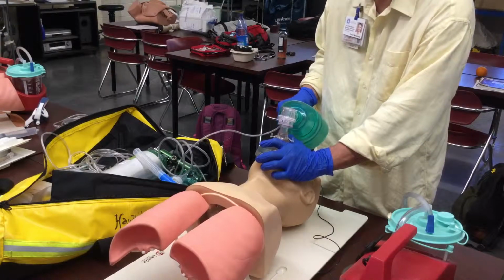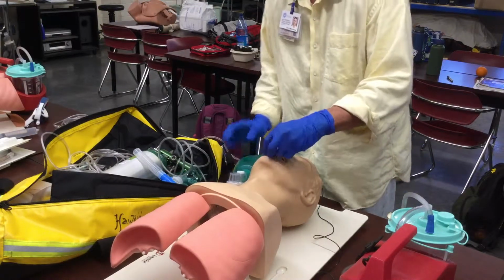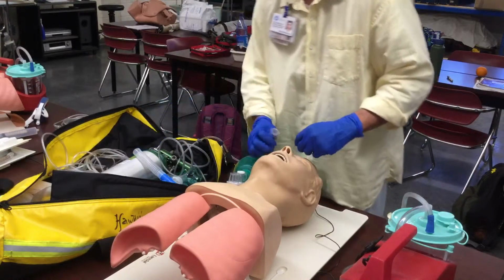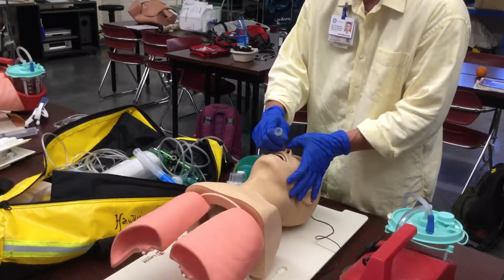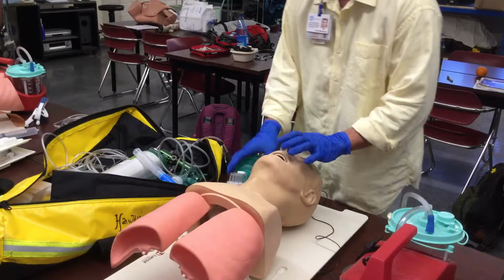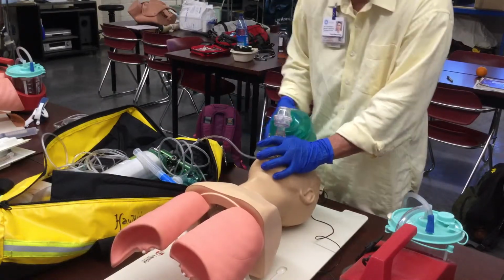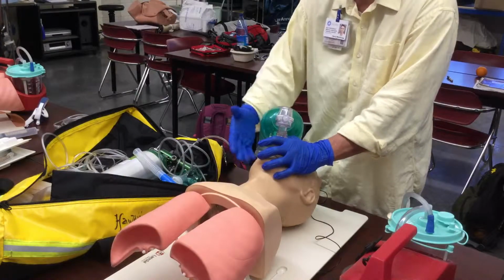The patient is gagging and becomes semi-conscious. So I go ahead and take the oropharyngeal airway out in line of position. Go ahead and measure my nasopharyngeal airway, use it on the right side. Lubricate this with a water-soluble lubricant. I put the bevel towards the septum and introduce the nasal airway into the right nostril, and continue to ventilate my patient to maintain an open airway.